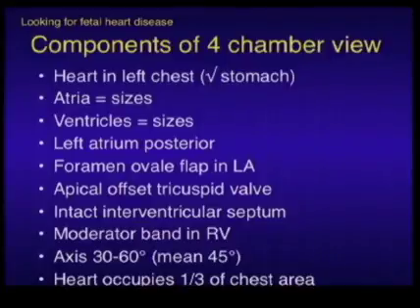It sounds simplistic, perhaps, to say the heart should be on the left side of the chest, but the heart should be on the left side of the chest. And if it's on the right, even if the stomach is also on the right, that can represent a problem. So you need to know where the head is, where the breech is, the spine, the stomach, and the heart, and be sure you know the sidedness of the baby.